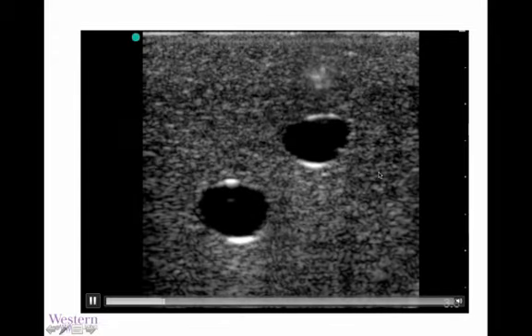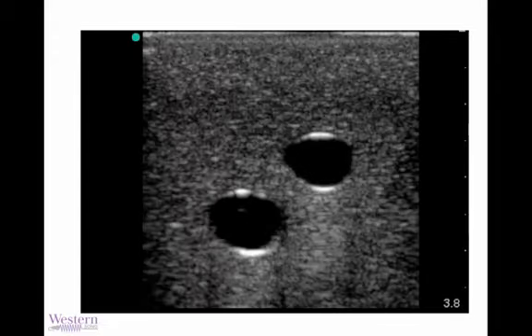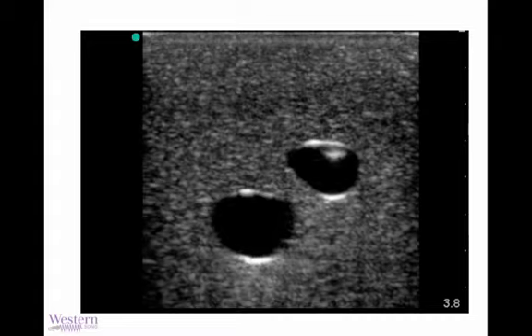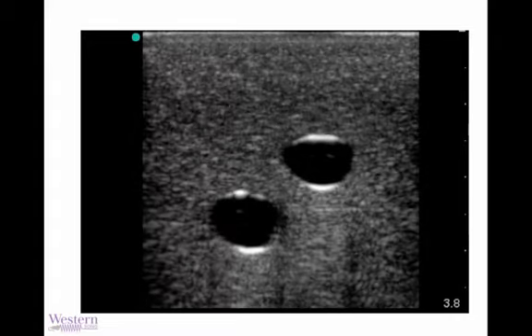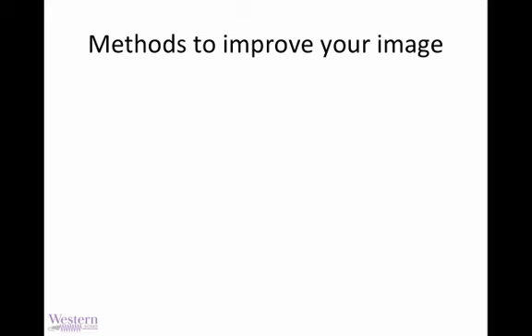Needle, and we know it's the tip each time because each time the operator moves the ultrasound beam beyond the hyperechoic spot just a little bit, and each time slides the needle back into the plane. So this is really expert stuff, and what I hope all of you can achieve.